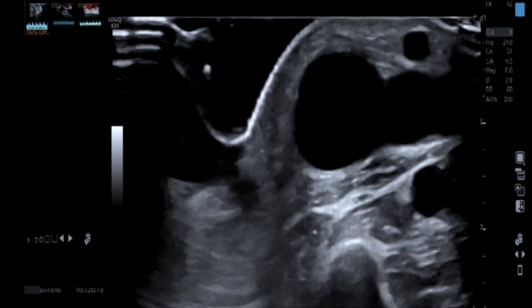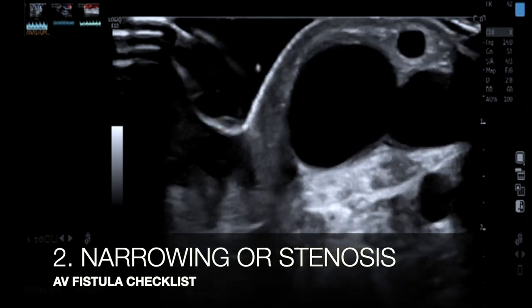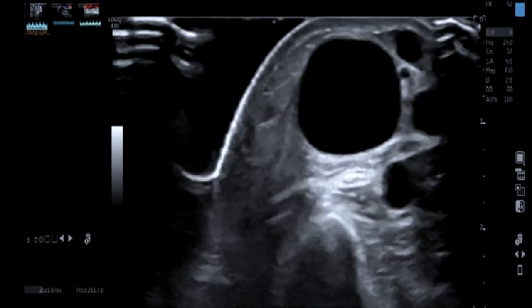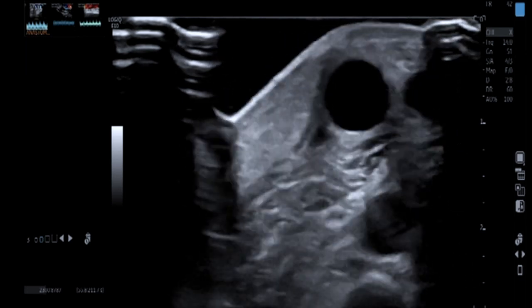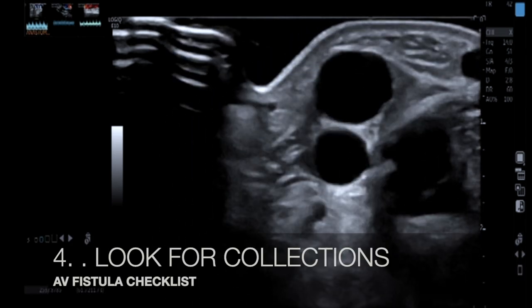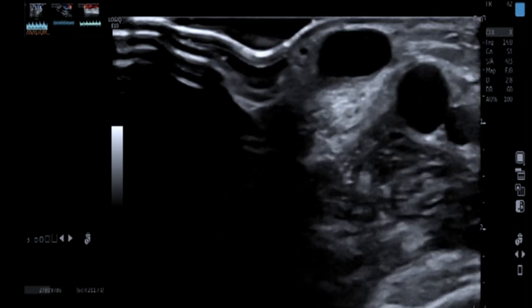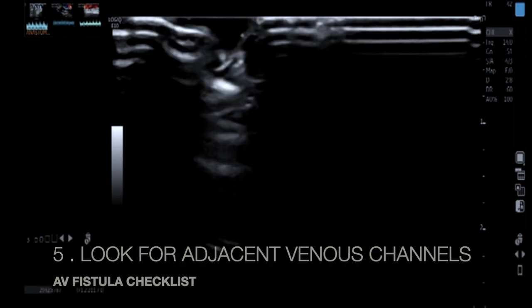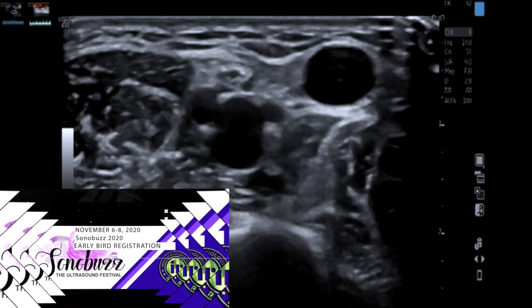I trace the draining vein entirely along its course with copious gel and minimal compression. Along the course of the draining vein, it's important to look for any thrombus, stenosis, or narrowing — which you can pick up on B-mode itself — as well as venous wall integrity, aneurysmal dilatation, and collections around the draining vein. Also look for accessory venous channels going deeper, as these can divert fistula flow and hamper adequate dialysis. Keep this in mind.